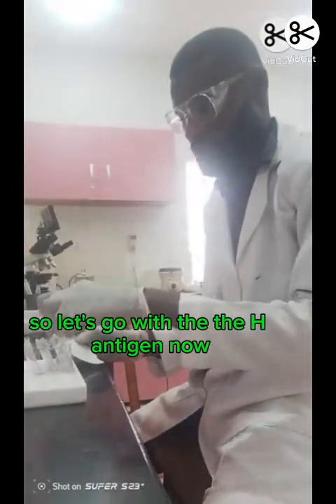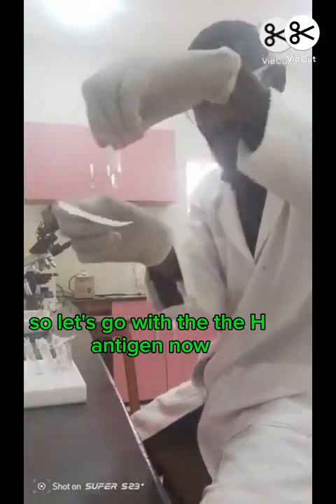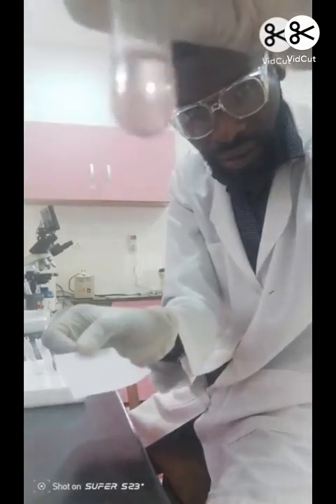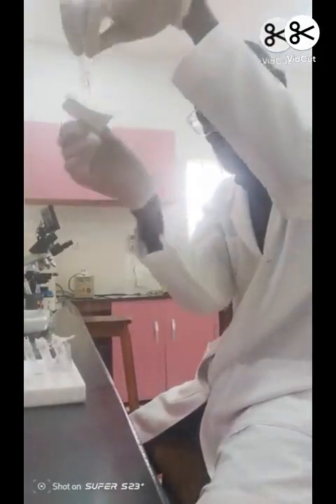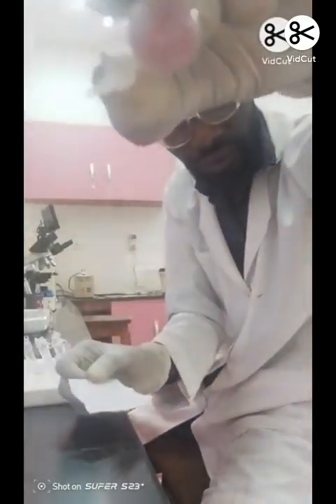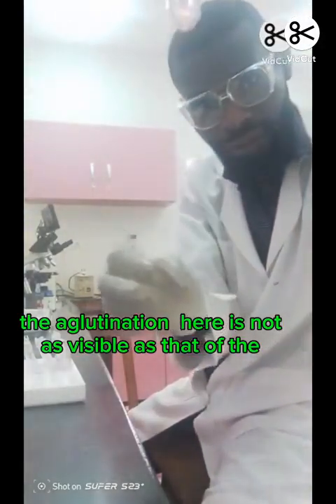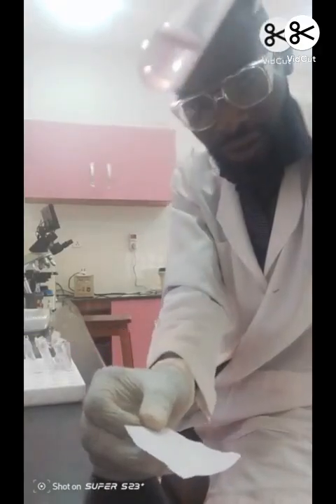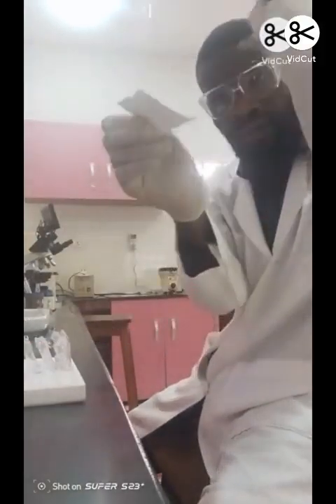So let's go with the H antigen now. There's a bit of mild agglutination there. The agglutination here is not as visible as that of the O antigen.